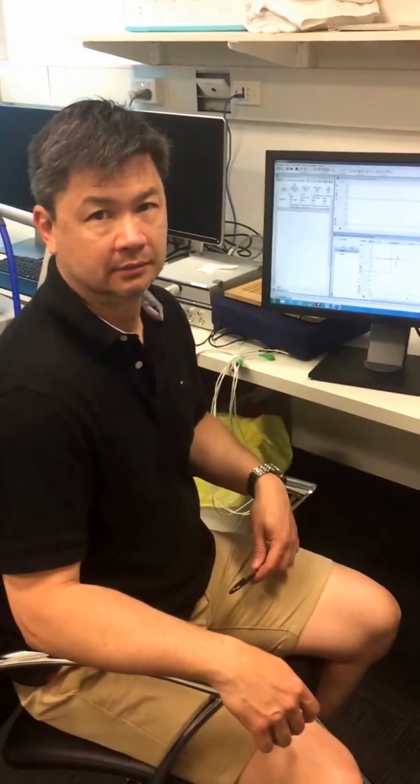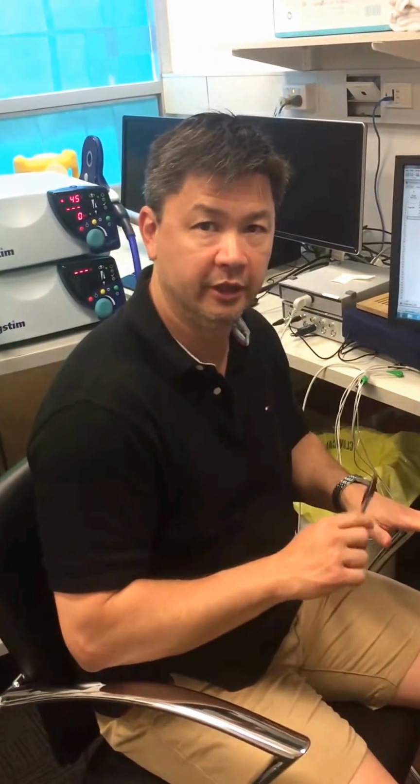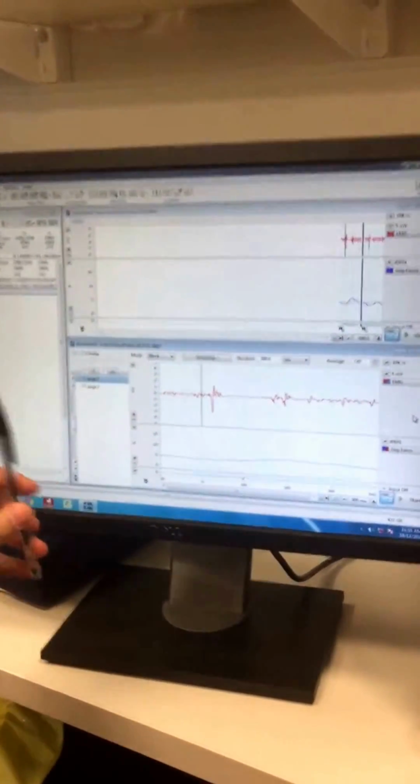We've seen the work you've done, so this now goes onto the computer, obviously, for you to be able to read. So can you show us through? Sure. So when I stimulated your brain and you got the response in your hand that was measured by the sensors, what we have is a waveform response that comes up. And I look at three things.